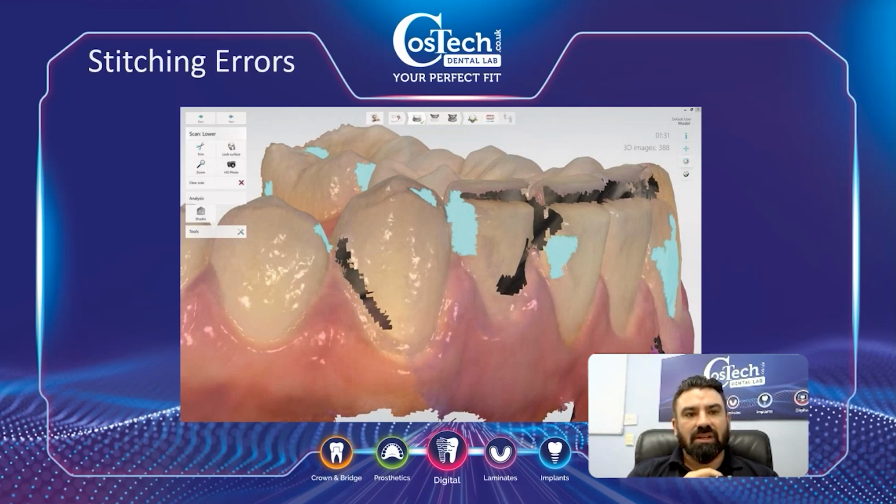If that happens, it's better to go back and rescan. If it's just in one area, delete just that area. But if it's in the majority of the anterior region, it's best to rescan because there's a high chance that drifting has happened during the scan, which will then give us an improper scan to work on.